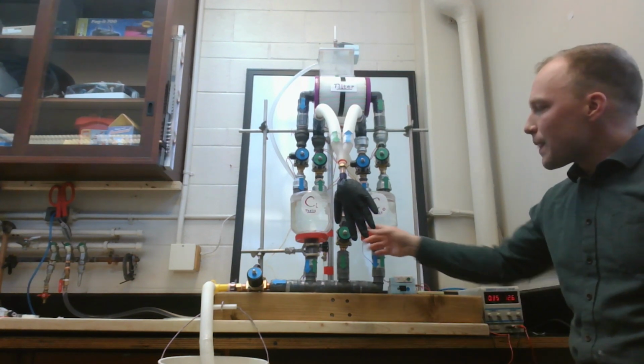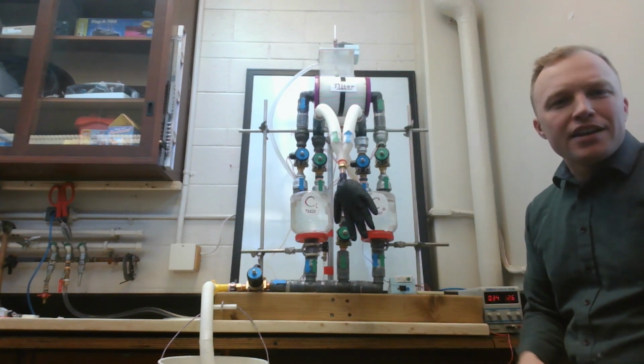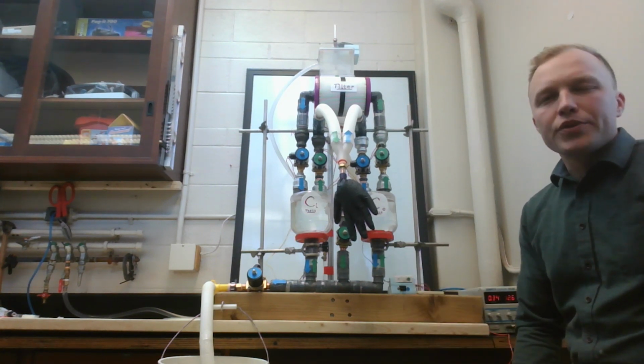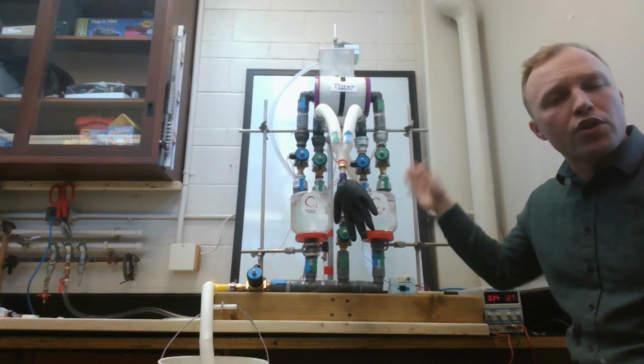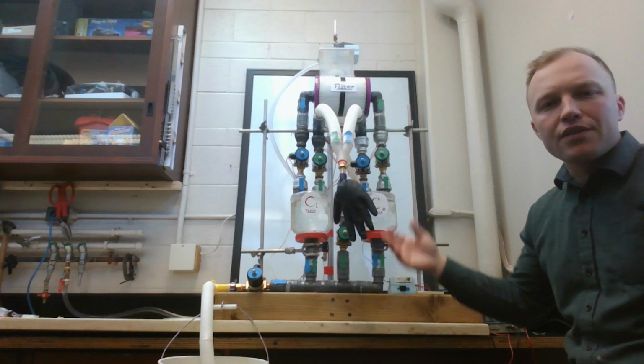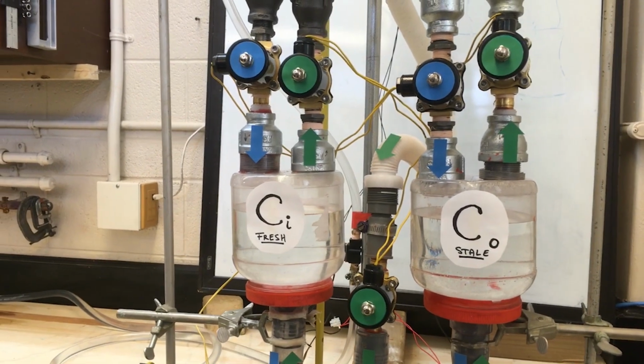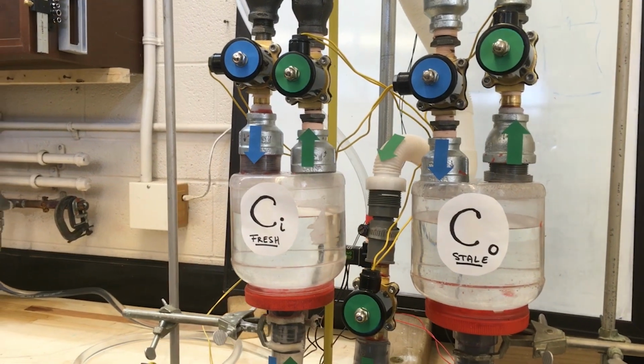These valves are regulated to over maybe 80 psi. That's way too much. That's almost a few hundred times more pressure than we're actually providing to them in this system. So we need a more low pressure valve system to improve the design, and we need to expand the inner diameter of the plumbing system.